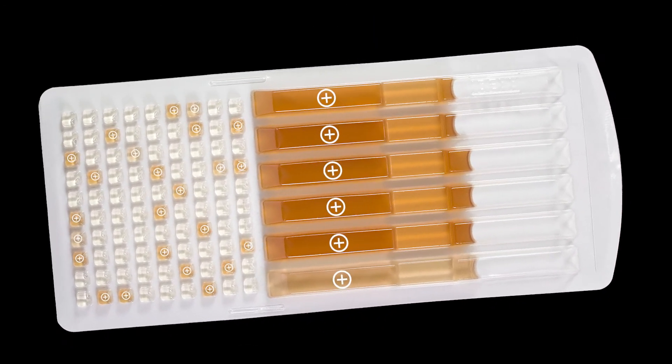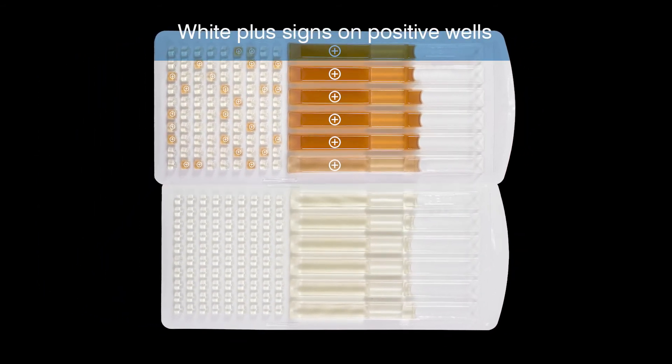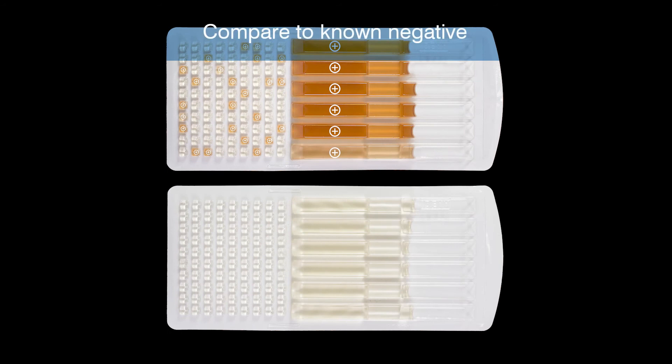Here is an example with both strong and weak positive wells. There are a total of six positive large wells and 24 positive small wells. If you are unsure whether a result is positive, compare the sample side by side with a known negative sample.